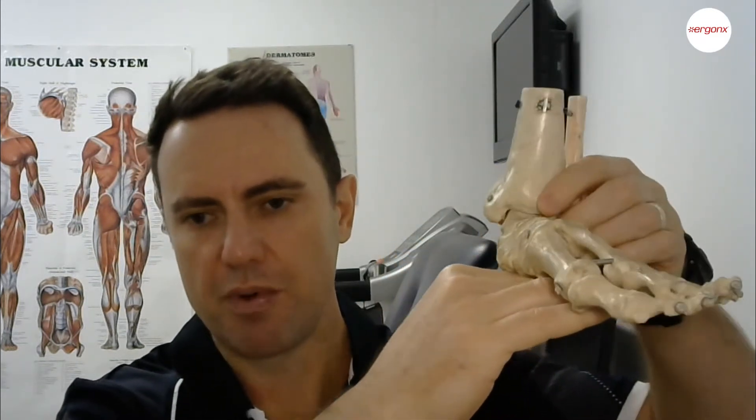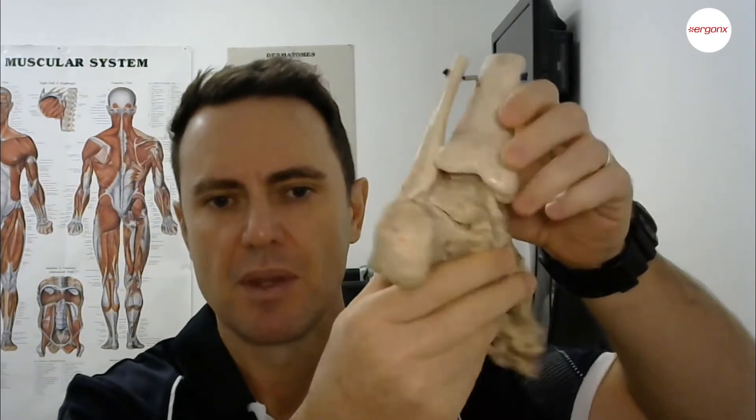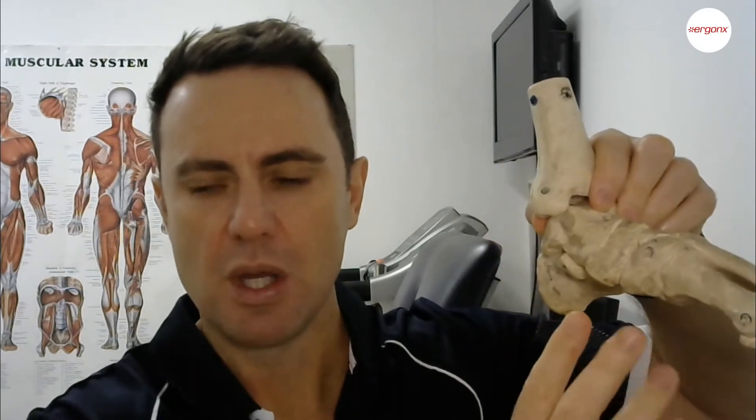What an orthotic does is help to support this arch, to prevent your foot from rolling in, and it also helps to prevent the rear foot from rolling in. That's very important because when the arch collapses and the foot rolls in too far, the muscles that help to support the foot have to actively try to control this and pull the foot back into its normal position.